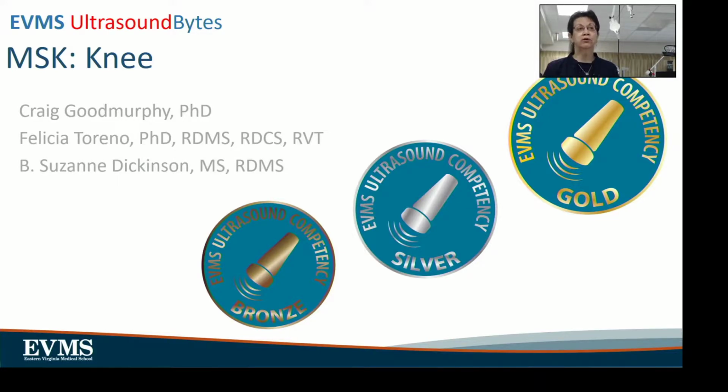Today we're going to be doing another MSK session, and hopefully you have already looked at the MSK General and can follow along with this one well. And we're going to be covering the knee today.